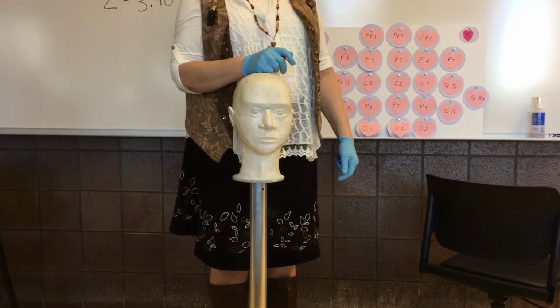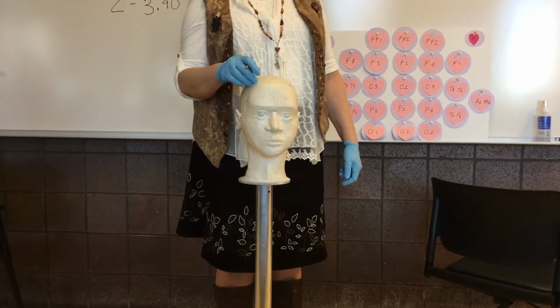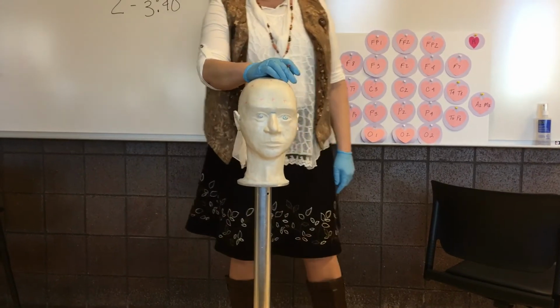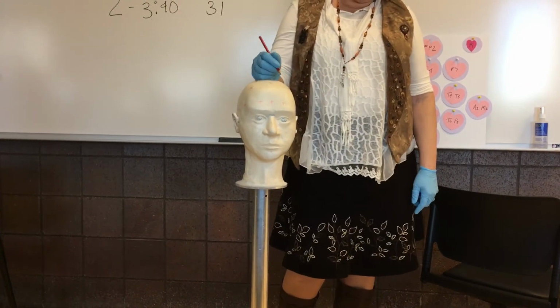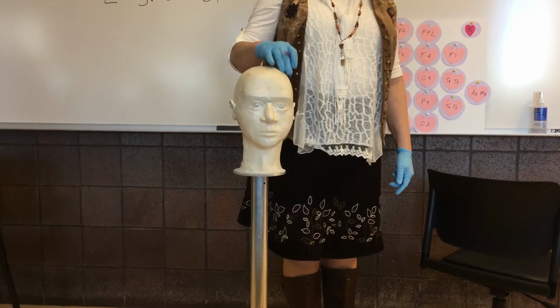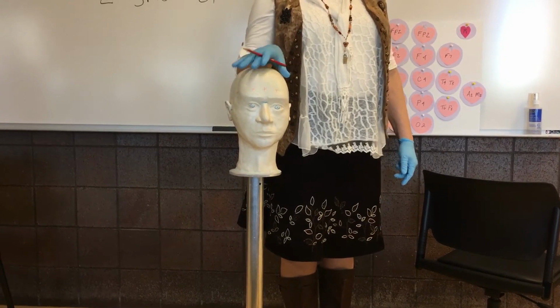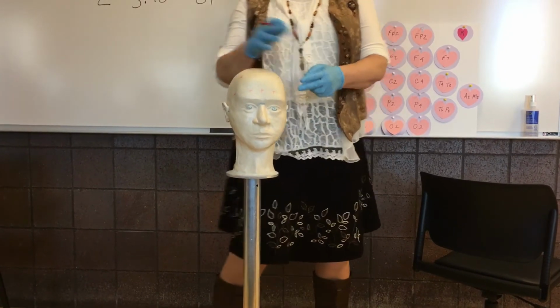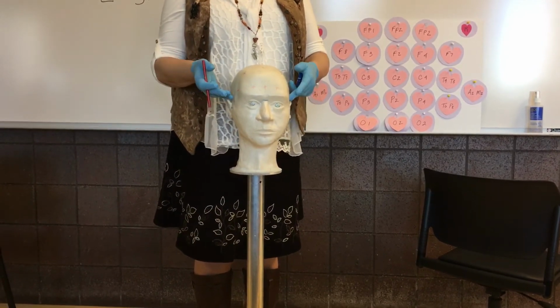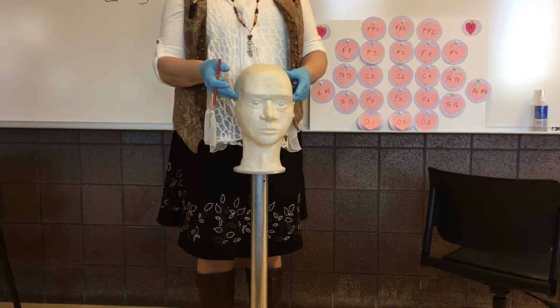If you're doing that, do you always have to add another on the other side? No? You don't. Well, unless there are some instances, which is called, I can't think of what that's called right now. But for the most part, you would map out the abnormality unless there was a horizontal dipole on the other side of the brain. Then you would. Where there's a negative pole here, positive here of abnormality. Sometimes that's seen in the temporal lobes. You probably wouldn't do it in PSG unless you're doing research.